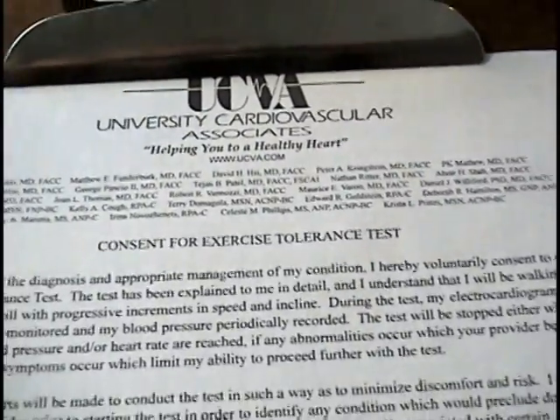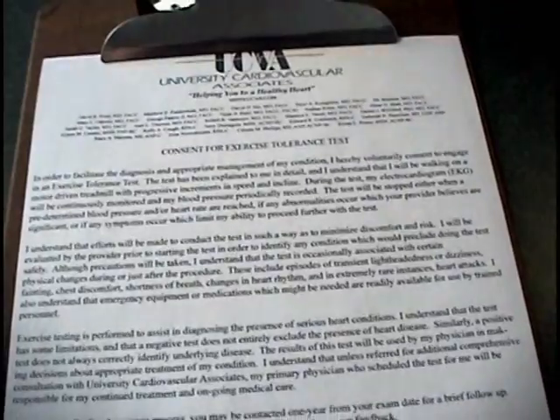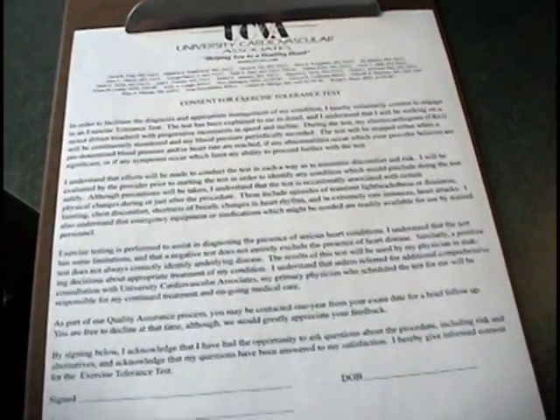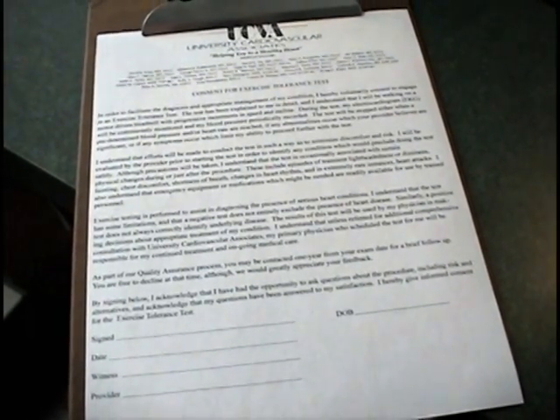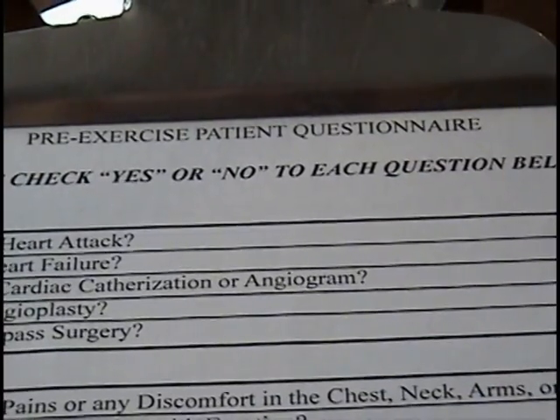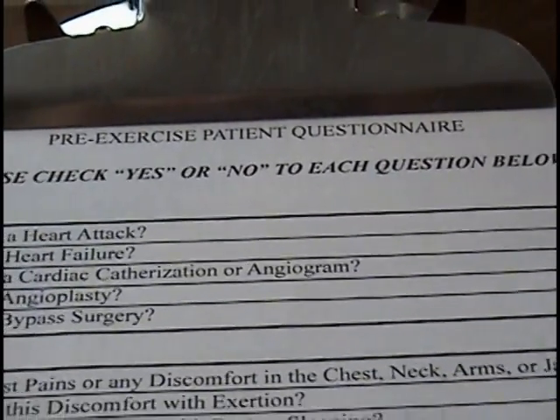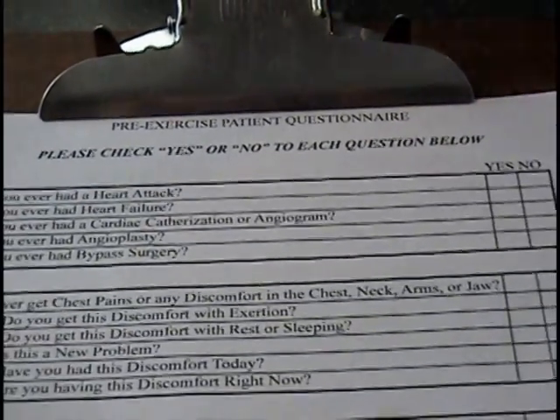The receptionist will then provide you with a consent form regarding the exercise tolerance test. This form will be signed before we begin and our staff will review it with you. The reverse side of the form is a questionnaire. Please answer these questions based on how you are feeling at that moment.